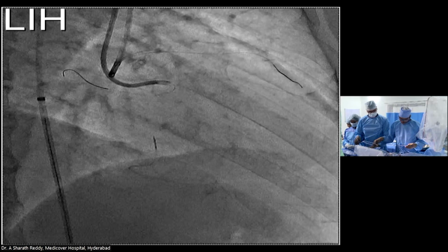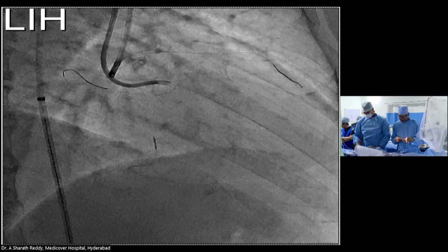If you want to strengthen the retrograde puncture strength, one idea is using the double lumen catheter through the retrograde approach. Yeah, we don't have that, Sasuke, with us. We can mark the workhorse wire and then take Sasuke and then we can puncture. I don't have Sasuke in my lab.